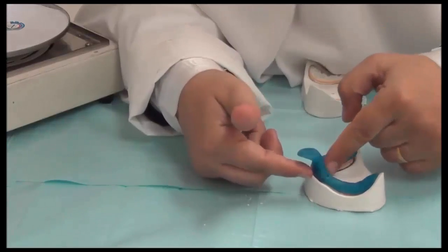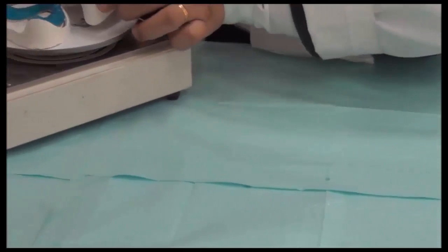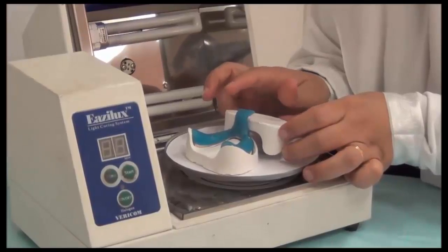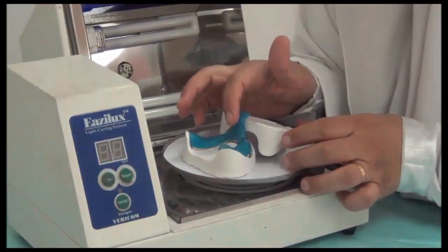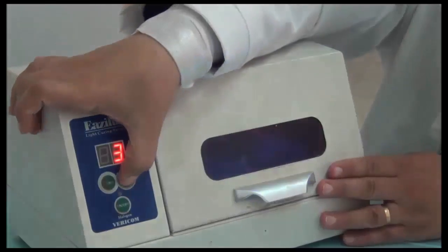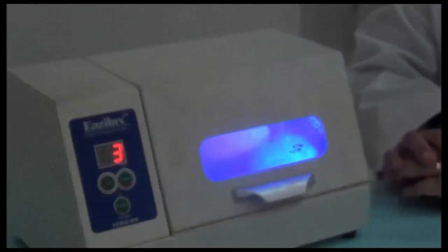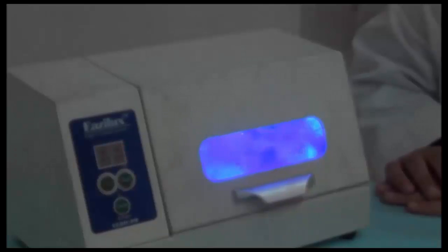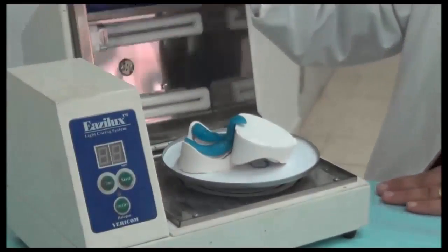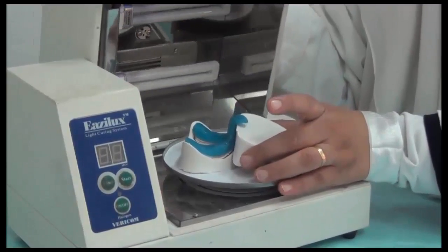So once more, I begin my curing with a material with support. I could place an old cast to do this purpose. I support my material so it doesn't slump in a manner that we don't want. We do an initial cure. We could wait for 20 seconds or more, and then once they are finished, we can open, interrupt the cycle, and then remove the support. It's still soft, so I'm not going to remove the support.